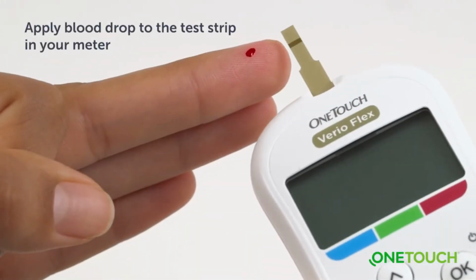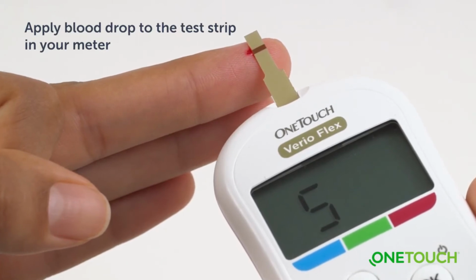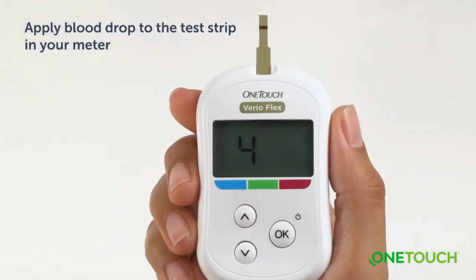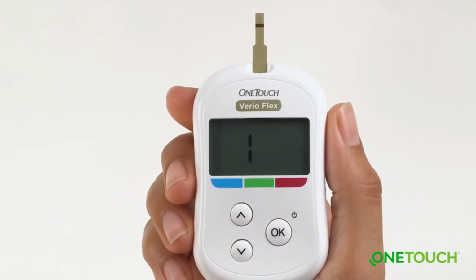Now, simply hold the meter at a slight angle, with either side of the test strip lightly touching the blood droplet, like this. When it touches your sample, the test strip draws blood into the channel. The channel turns red, and the meter will count down from 5 to 1, giving an accurate result in 5 seconds. Testing is now complete.